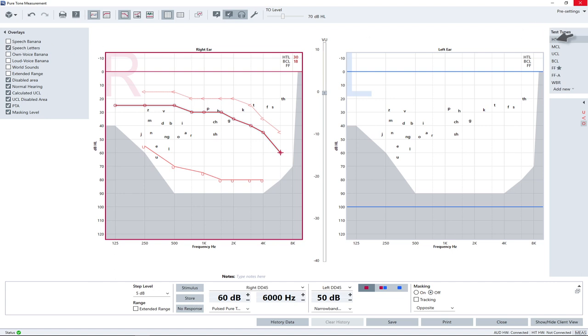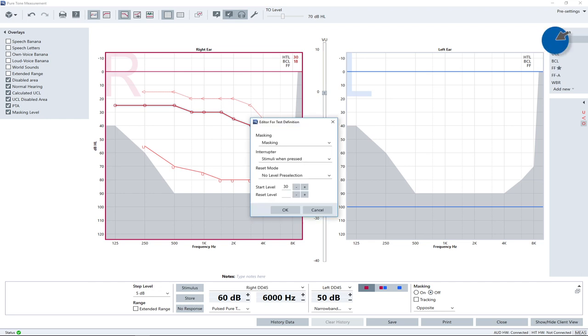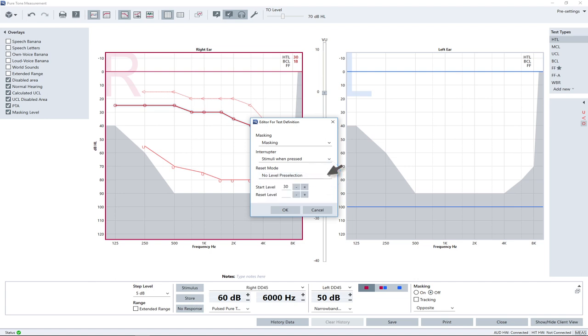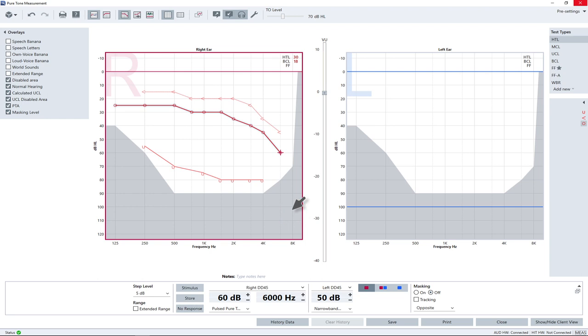When right-clicking on a test type in the test type panel, a submenu opens that allows you to quickly access the type of masking to be used, the settings of the interrupters and the kind of reset mode and start level for the selected test type. Changes in this submenu will not be remembered after closing the workspace. Use the test definition dialog to make permanent changes to the test settings.